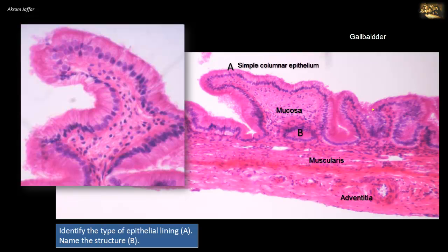Because the gallbladder concentrates bile, it needs a mechanism for absorption, so there are numerous short apical microvilli. These cells closely resemble the absorptive cells of the small intestine, but we do not have goblet cells here. In the non-distended state, the mucosa is thrown up into many folds. These mucosal folds might resemble the villi of the small intestine, but they vary in size and shape, display an irregular arrangement, and disappear when the gallbladder becomes distended.